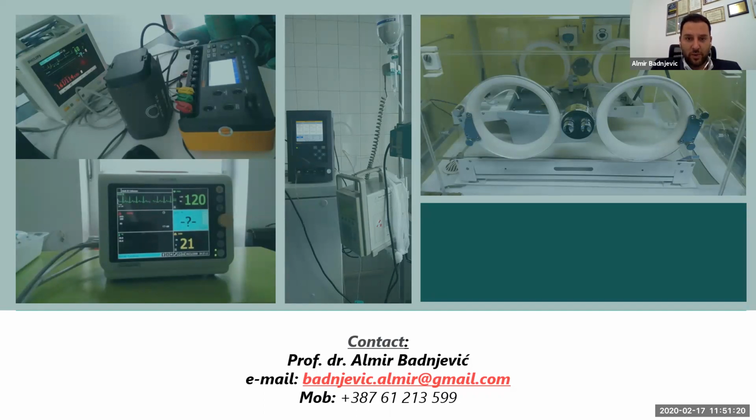What do you think about our test equipment that we send out annually for calibration to metrology? Yes, of course, every year you must send your test equipment to be calibrated, but only calibration in an accredited laboratory counts. It is very important, when you check an accredited laboratory, and by accredited I mean per ISO 17025, that if they say yes, we can do, for example, flow, you must check at which points they can do it, in which range they can do it, and with what accuracy. If their accuracy is worse than or the same as your device, then don't go to that lab, because they cannot calibrate your testing equipment; your accuracy may be better than that of their calibrating device.